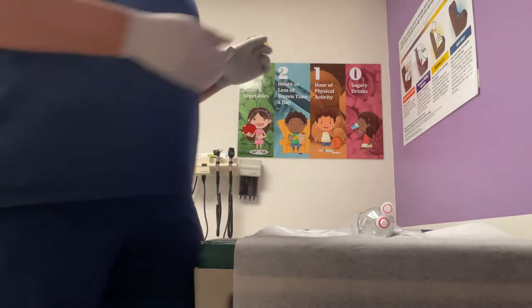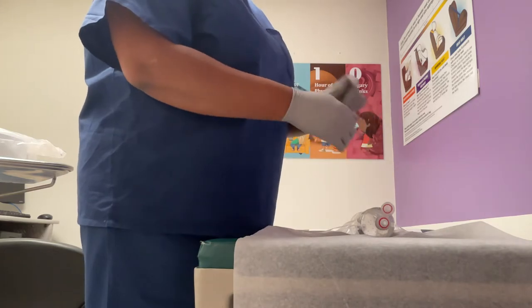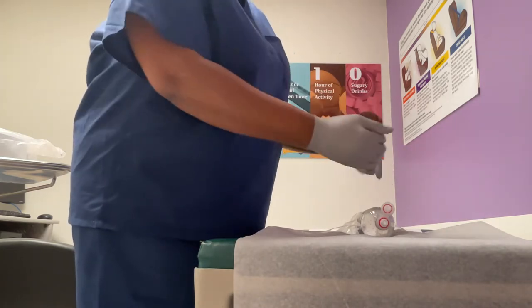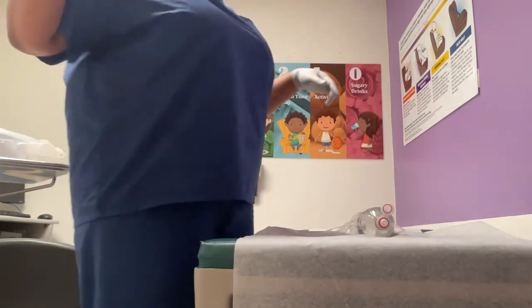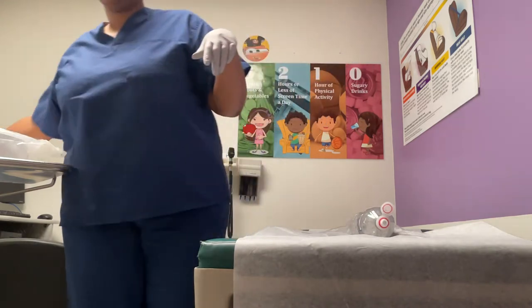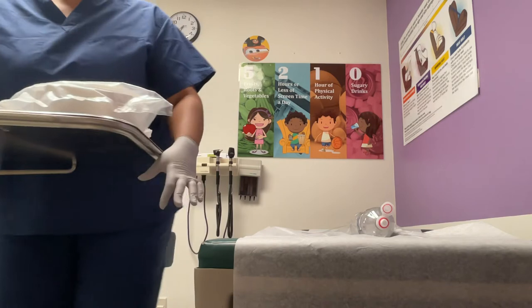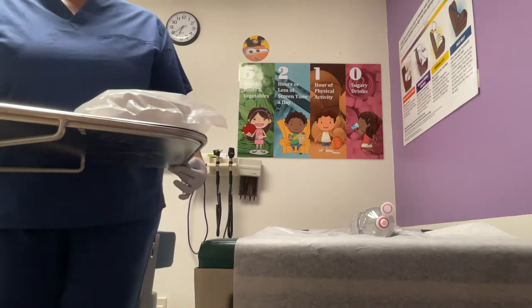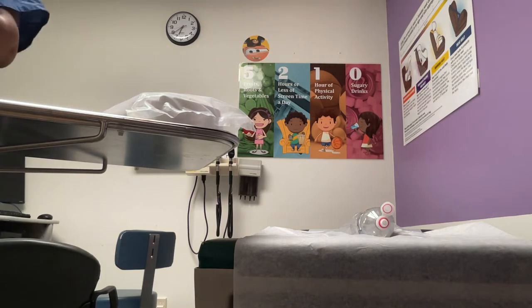Then I will rinse: wipe, turn, wipe, turn, then go down the middle. Then we're going to get the towel and dry. We have you all cleaned up — are you okay? I'm going to take my gloves off and wash my hands again.